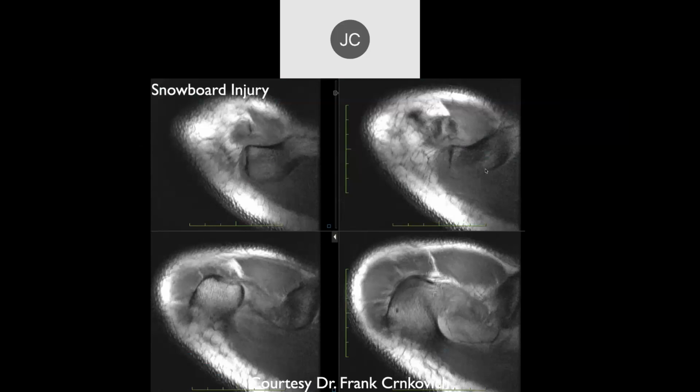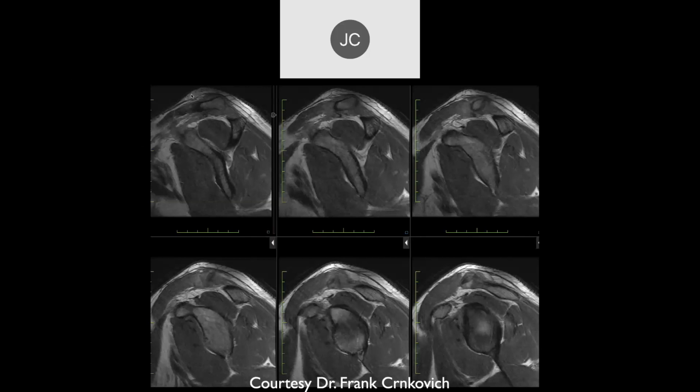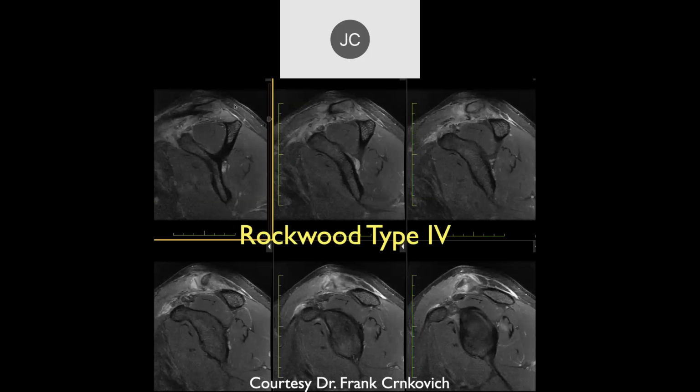Yvonne, here's a snowboard injury. Having some difficulty making out. So I think that's on the two images at the top. Is that the clavicle that's kind of posteriorly? Yeah. Here, so it's actually coming posteriorly, right? Yeah. Here you can see on the sagittal images the distal clavicle is posteriorly positioned. And so this is another Rockwood type 4.